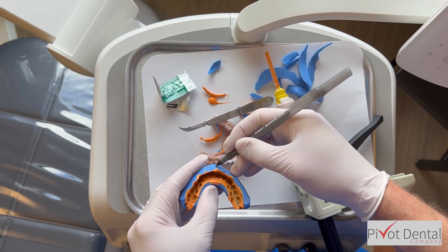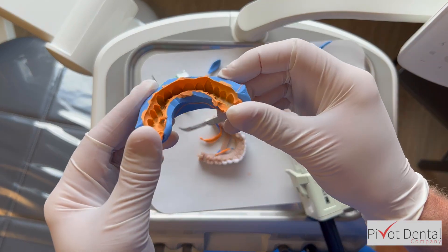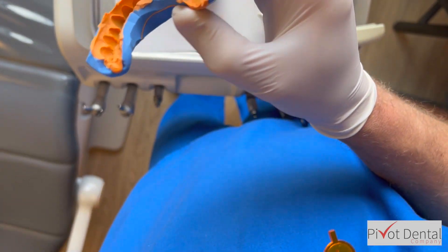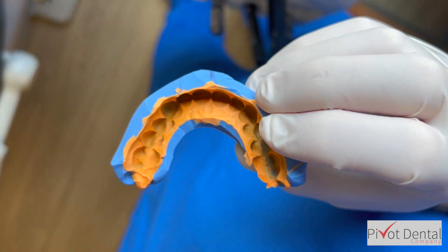Again I take that pen and mark 8-9, as I'll need that when I go to the mouth. Taking a closer look, you can see it captures the detail of the gum line on the facial, lingual, and incisal surfaces — it's all right there. And that is your putty matrix.